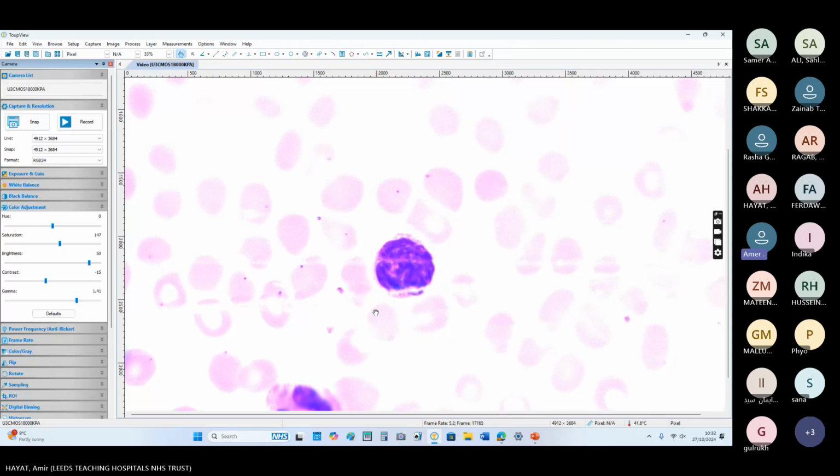Now this cell which is in front of you has a central line in between and folds on each side. It resembles more a cerebrum than the cells of CLL. In CLL, you do not expect to have eczema or erythroderma. And these cells are a bit larger than the cells of CLL. In CLL, cells are almost the same size as the RBC.